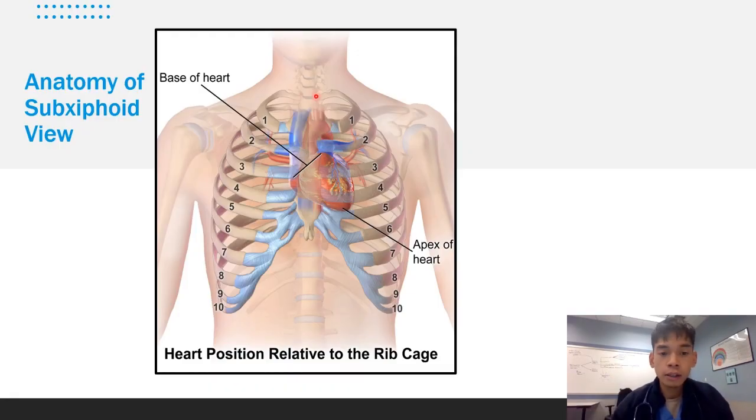So beginning on this slide, notice the slide's title change from the pericardial view to my own personal preference, the subxiphoid view. Now that we're all on the same page and we know that the probe is going to be underneath the xiphoid process, fanning upwards towards the heart, you could use pericardial view, but now that we know it's the same thing, okay?